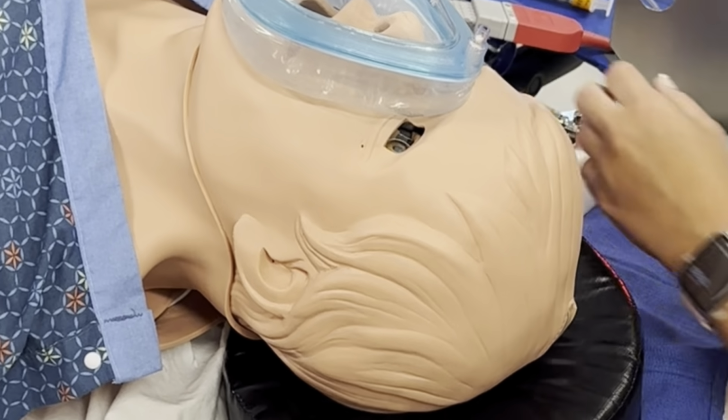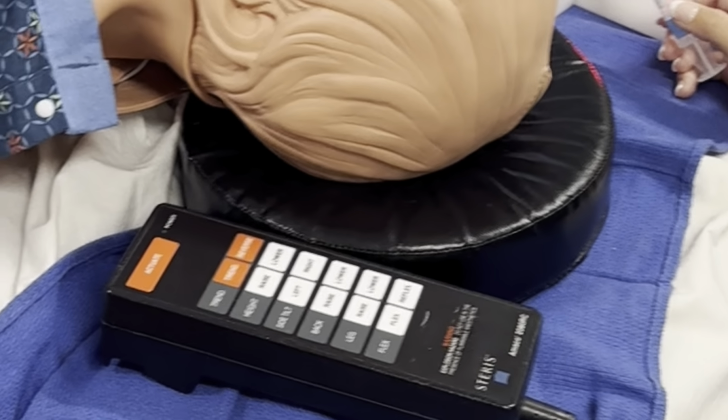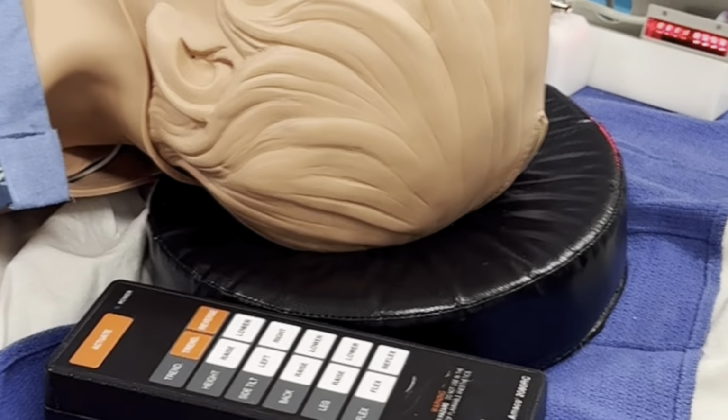And so there's barcodes on those syringes. So over here on the machine, I'm able to see what she just gave. And then the mannequin, it will react according to what drugs are there.